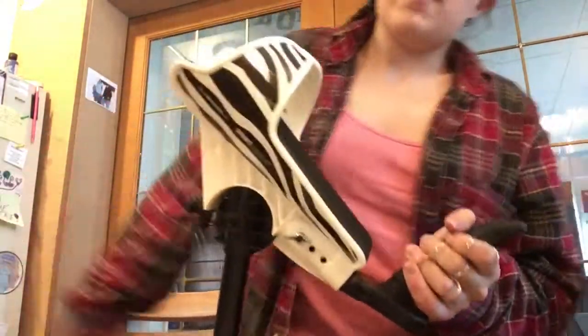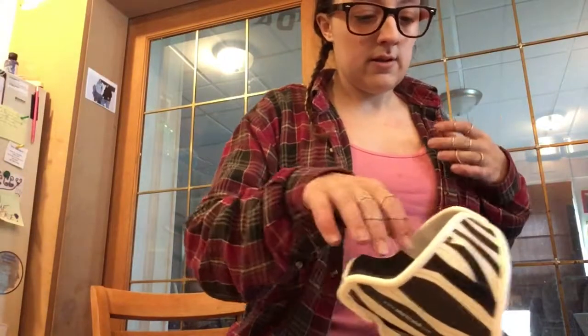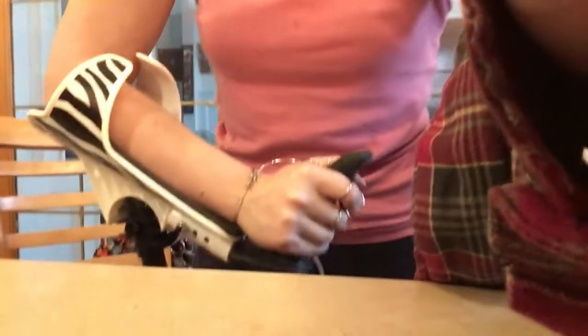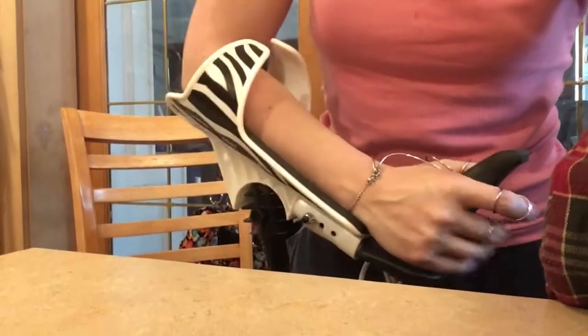When I put my arm through it, it's hard to see with my flannel on. I suppose I could take off my flannel, but I just like to be cozy. When I put my arm through, it's supposed to be no more than an inch from my elbow. So I'm trying to determine what that inch is exactly. I think that that's a decent angle, but I'm still trying to play with it because I really don't want to hurt my wrists.